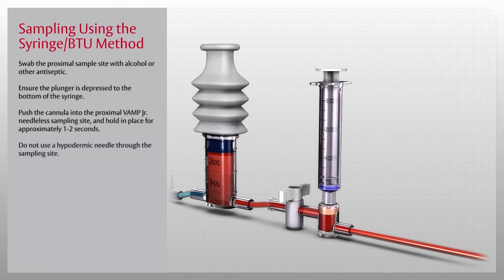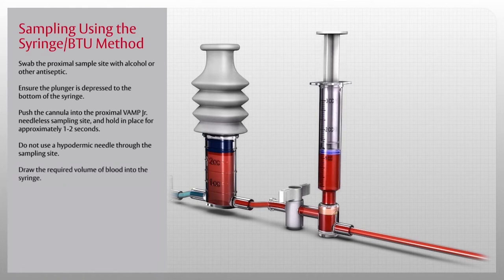Note, do not use a hypodermic needle through the sampling site. Draw the required volume of blood into the syringe.